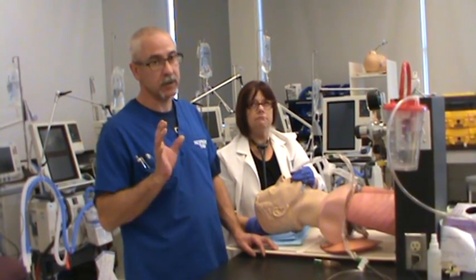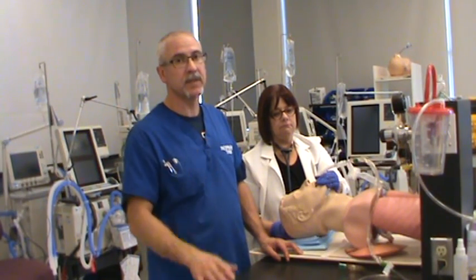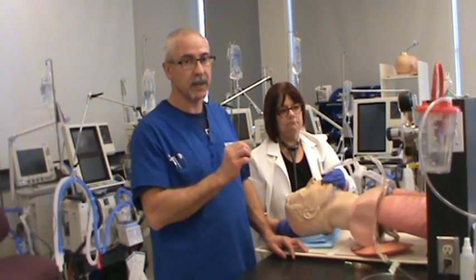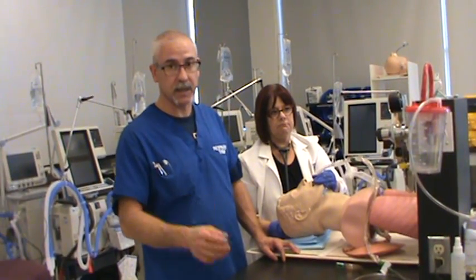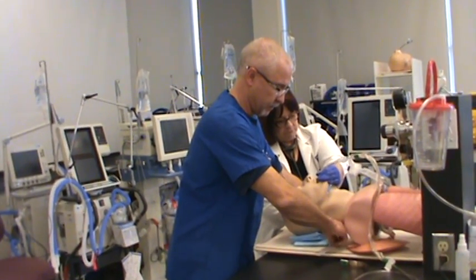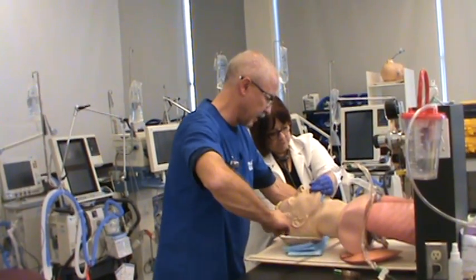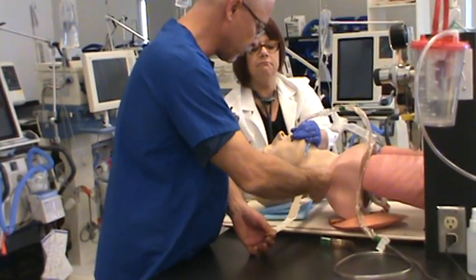Now when you're taping the tube in, you should have gloves on. Diane's got her gloves on. I simply took my gloves off so I can show you an easy way of taping the tube in place without having any problems with the tape sticking to my gloves. The first thing I'm going to do is take the tape, and Diane's going to support it. The person assisting you is very, very important.